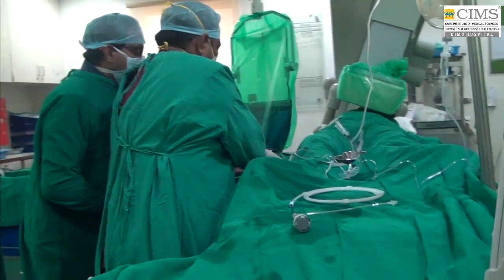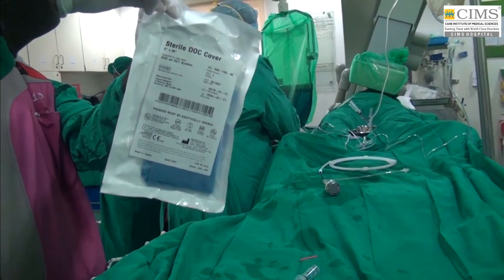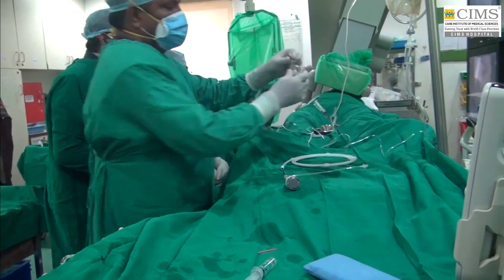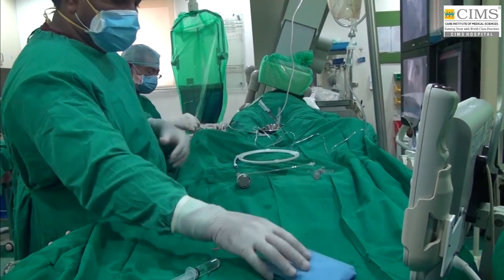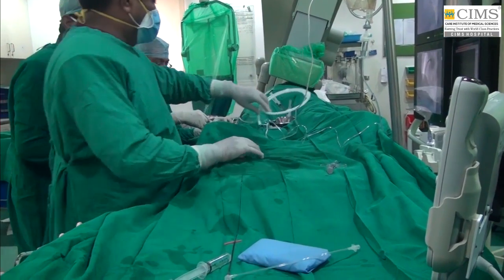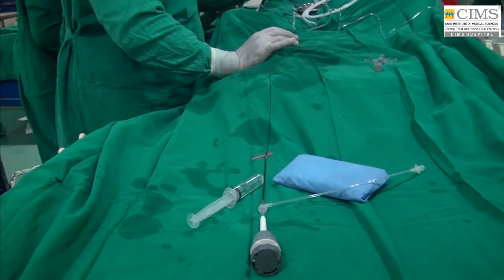Yes, and it's a fairly long lesion spanning 3 to 4 to 5 centimeters, and it's a variable diameter artery, looking fairly large proximally and tapering off. In our previous era, or even just a few years ago, we used to do judgment and open up the arteries. But in the era of imaging, we should always use imaging.